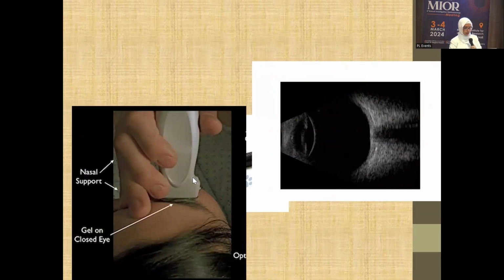Here is a probe, okay, and here is the marker in the form of a dot, or it may be in the form of an arrow, small arrow, okay? It's different from one instrument to another instrument. This is another instrument where you can see the arrow in another place.